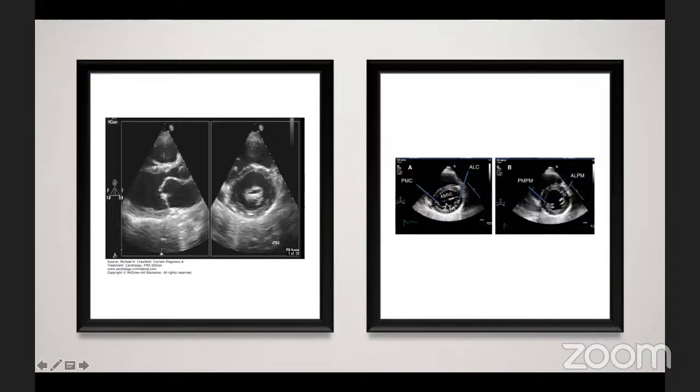You can see this is the anterior mitral leaflet near the septum, and this is the posterior mitral leaflet near the lateral wall of the heart. And this is the mid-papillary muscle. So you can assess the leaflet anatomy and the papillary anatomy as well. You can appreciate here the hyperechoic, calcific, thick leaflet tips and small mitral orifice. This is the fish mouth appearance, characteristic of rheumatic mitral stenosis.